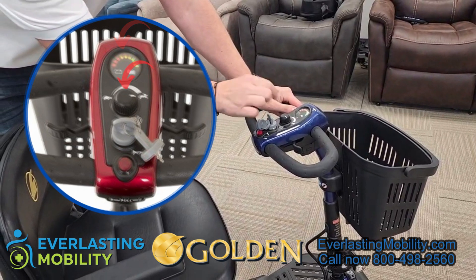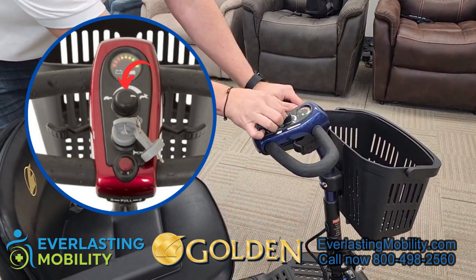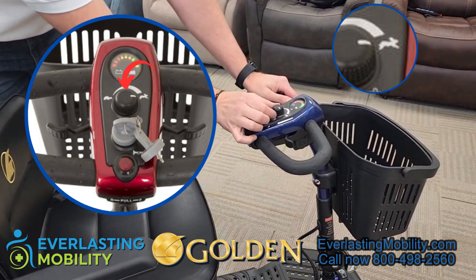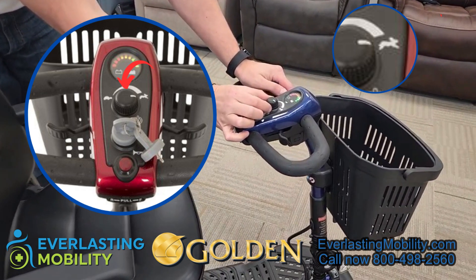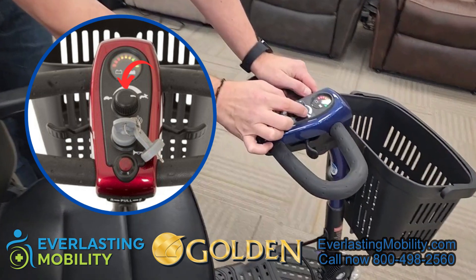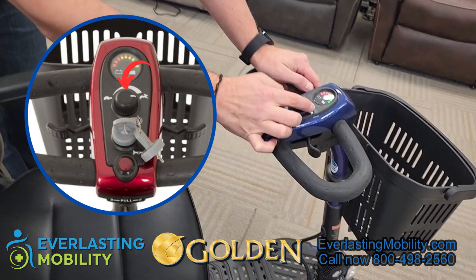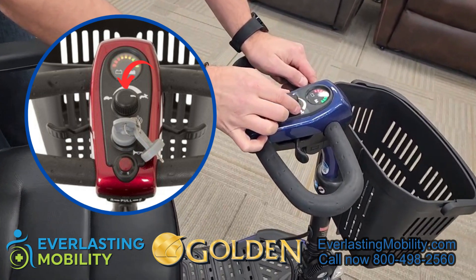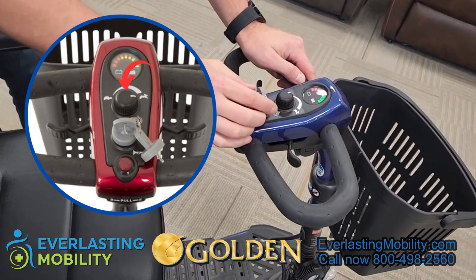There's also a speed control dial. If you want to go the full maximum speed, turn it up to the rabbit and the top speed is around four and a half to five miles per hour. If you want a lower speed — say you're riding in a store going around tight corners or crowds — you turn it towards the turtle and your top speed would be around two miles per hour.